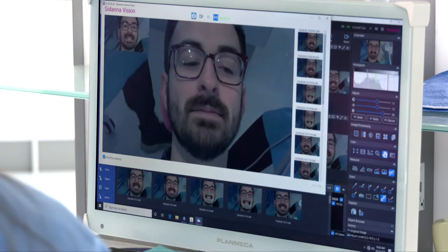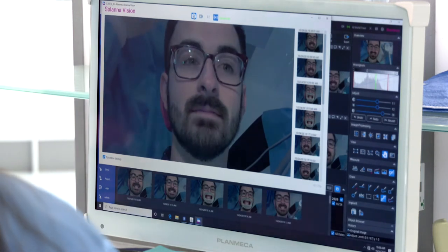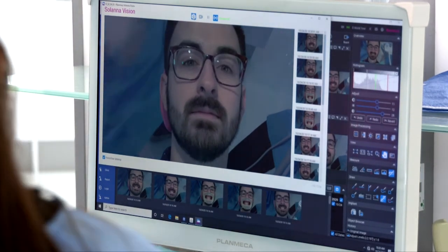Basically, every patient that comes in, the first thing I'm doing is snapping some videos and some stills of that patient. And it also really helps later on down the road when you want to show before and afters. And so the next step to digitizing my patient is going to be to generate some high quality intraoral scans.